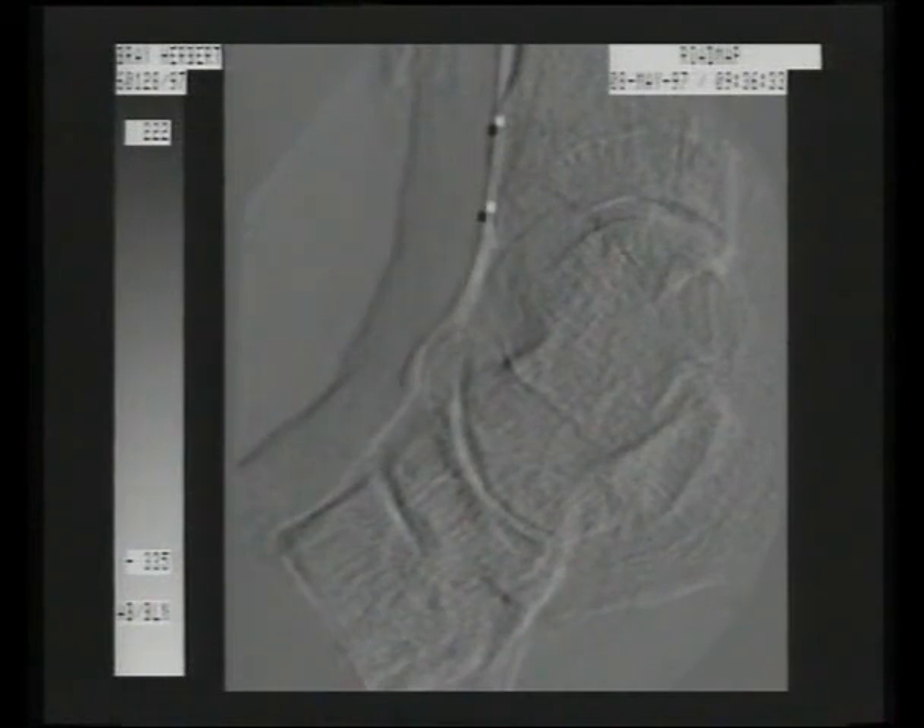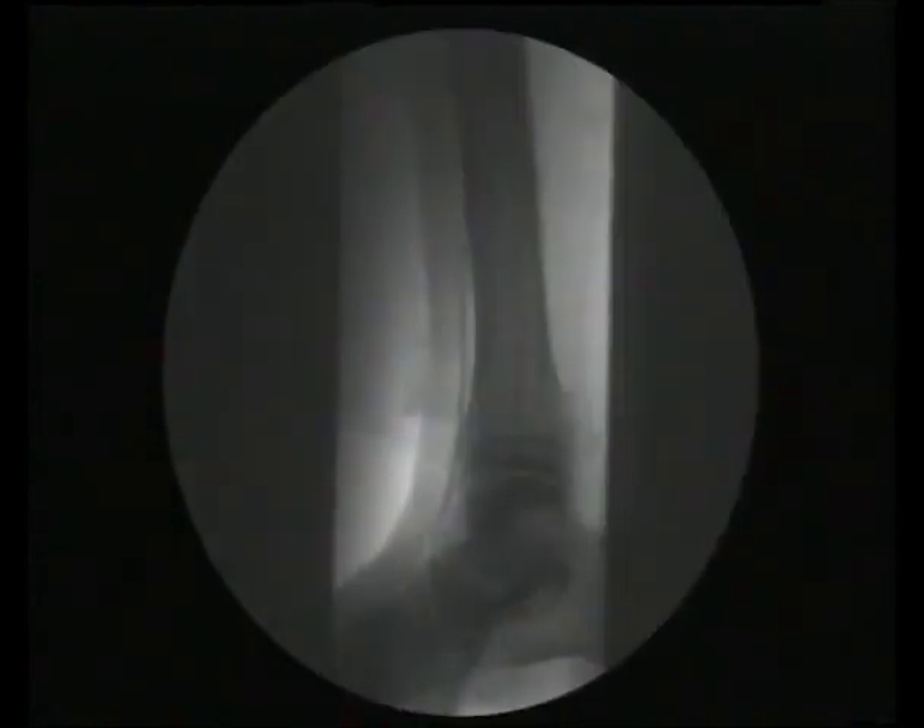Since proper re-entry was not made with a loop, we now look at the distal end again under heavy magnification and road map. This time the straight end of the wire has achieved entry into the distal anterior tibial artery. Ballooning is done to tidy up the distal end, and the contrast is now freely flowing with the distal anterior tibial artery appearing to be a good vessel. The final angiogram shows free flow in the anterior tibial artery which is actually faster than the peroneal artery, confirmed in the upper leg as well. There is now good hemodynamics and therefore a good final result.